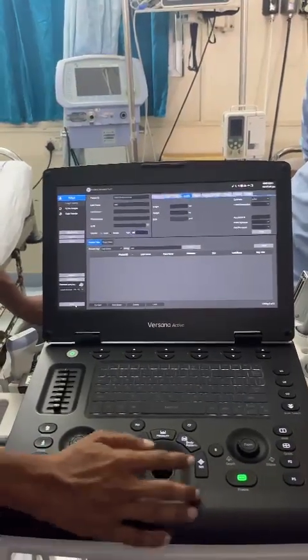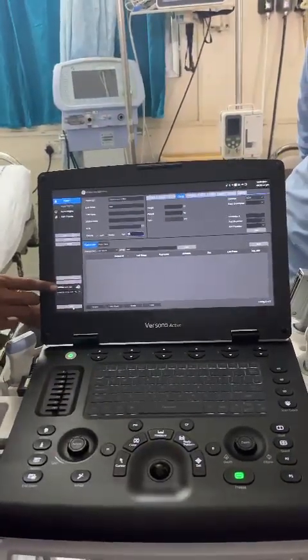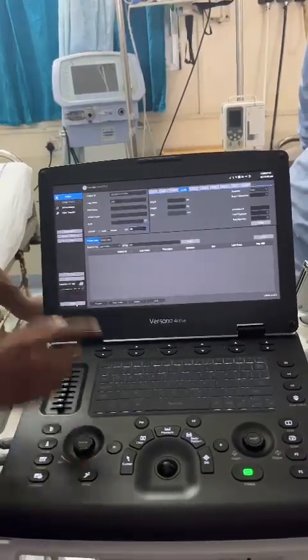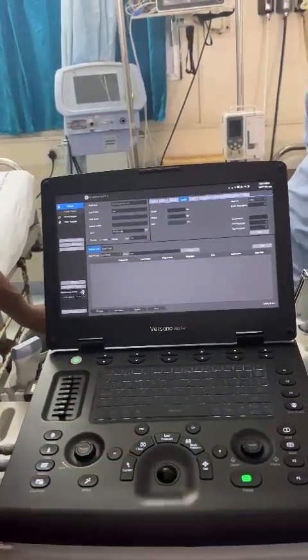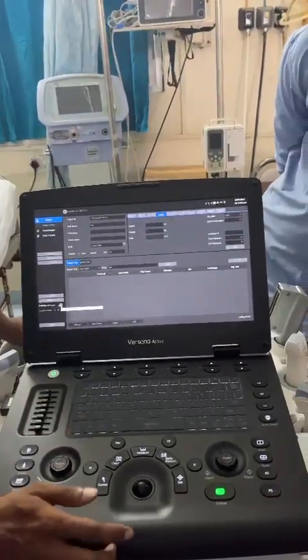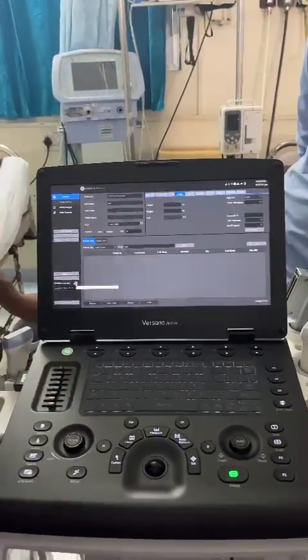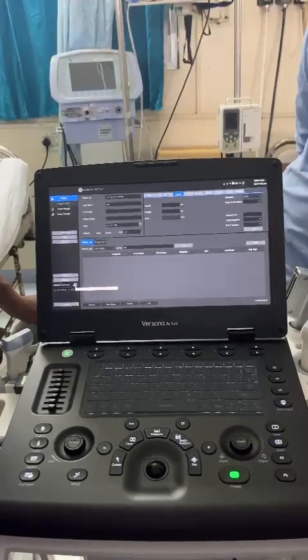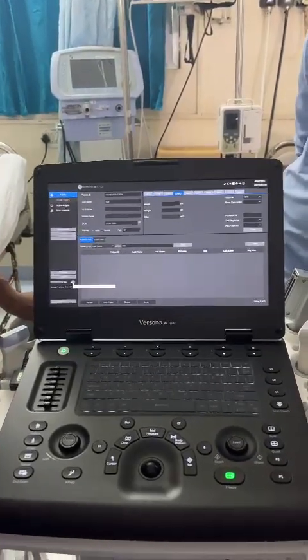Then you'll go to the scan engine. Here is our internal storage capacity — hard disk — which will be around 100 GB. If you observe that it is less than 55 GB, try to delete some patient records that you have.